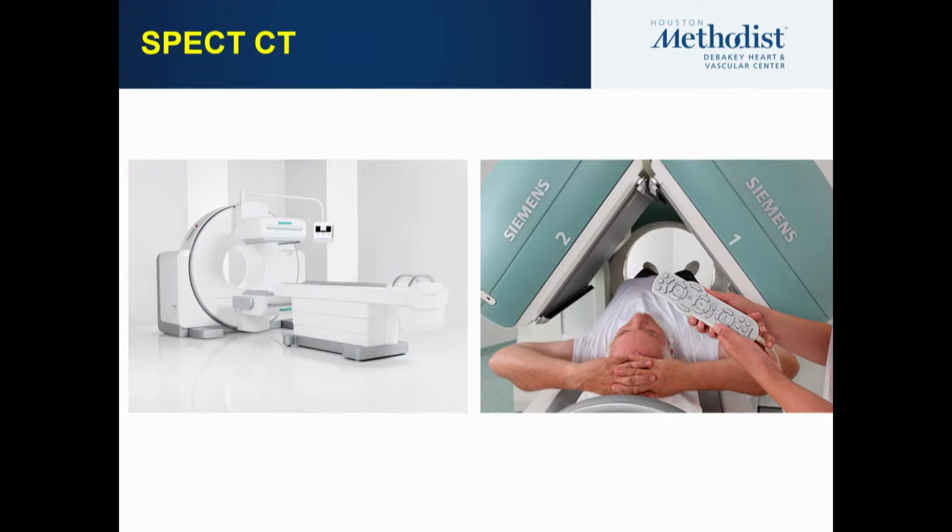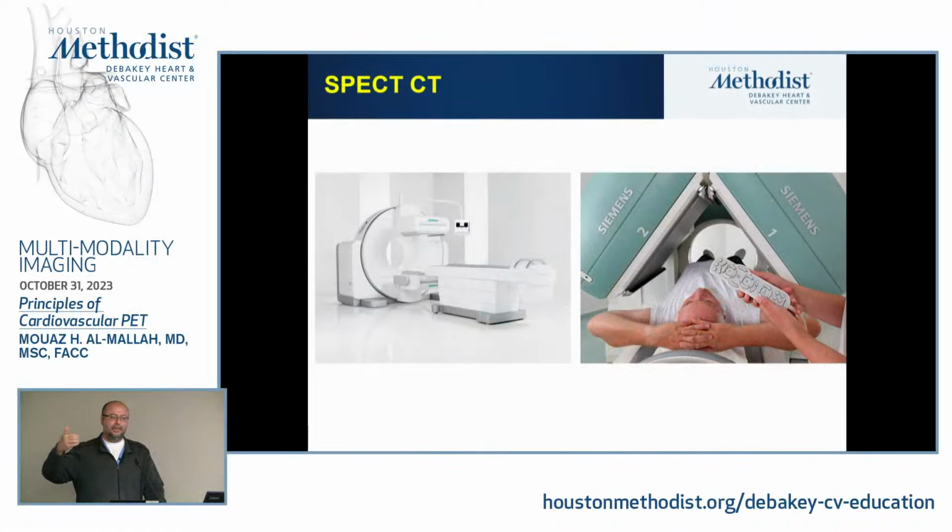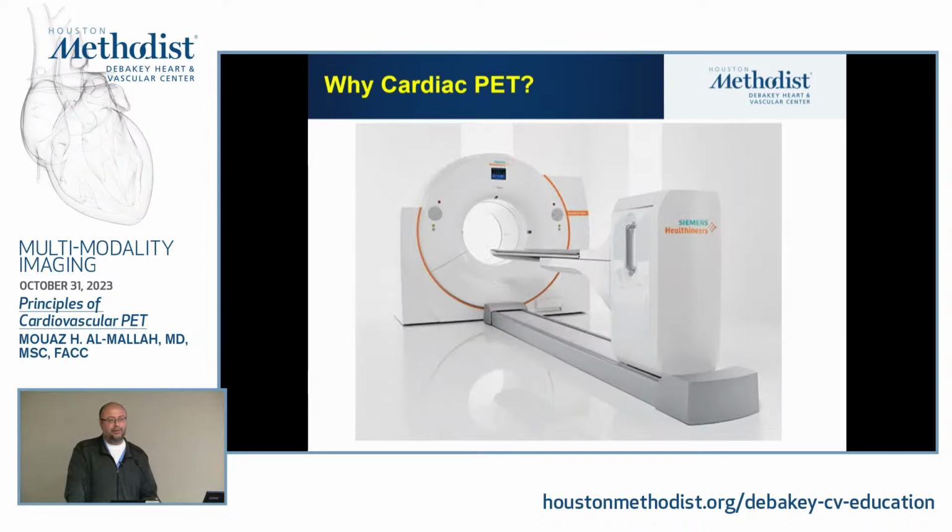So you already had a CT lecture. In CT, what we do is that there is a radiation source that will emit the X-rays, it will pass through the patient, and then we capture it from the back on the detector. So you have the X-ray tube and you have the detectors. On nuclear, the concept is that you inject the patient with the radiotracer, and then you have the capture of the radiotracer by these detectors that can be positioned by SPECT in front of the patient or on the side of the patient, or like what we get here, around the patient on the PET CT.